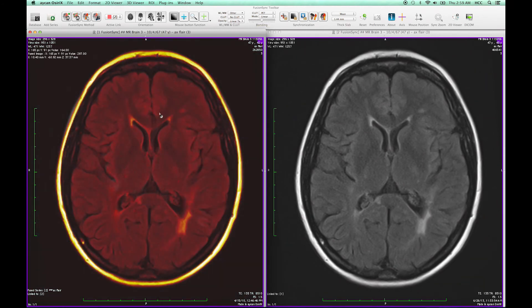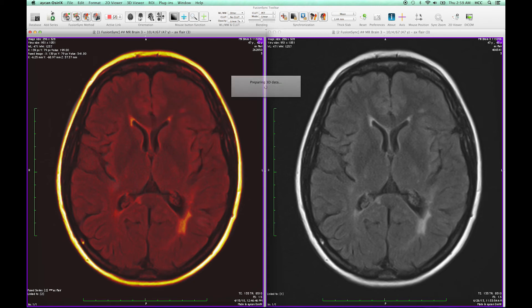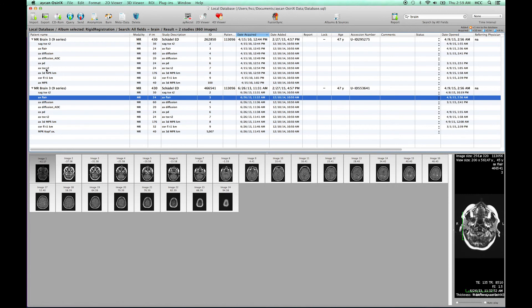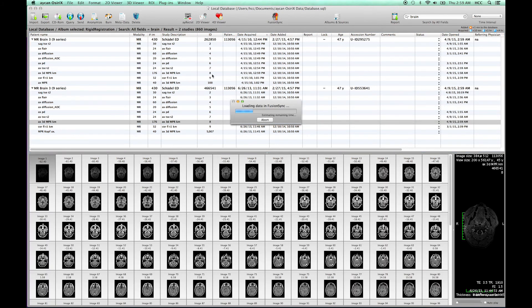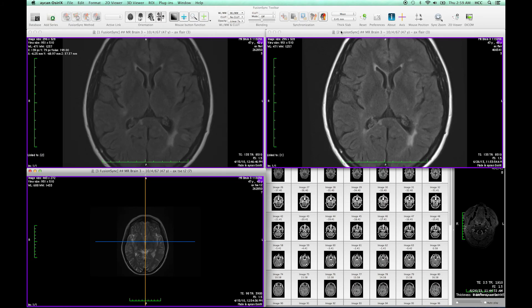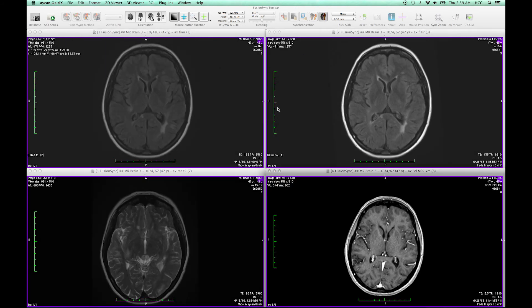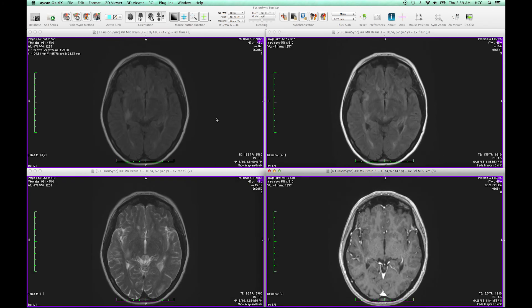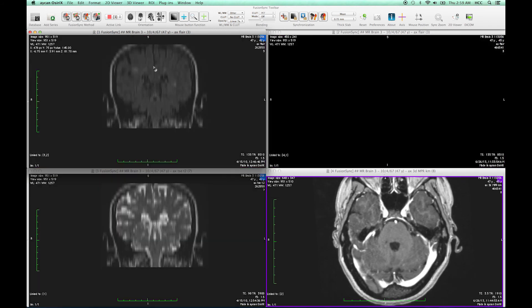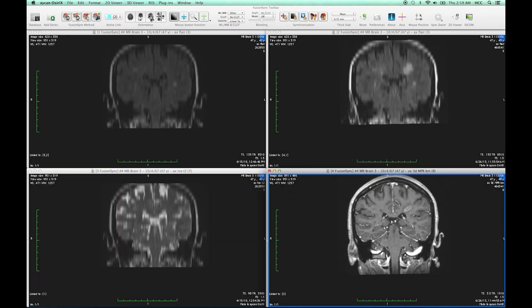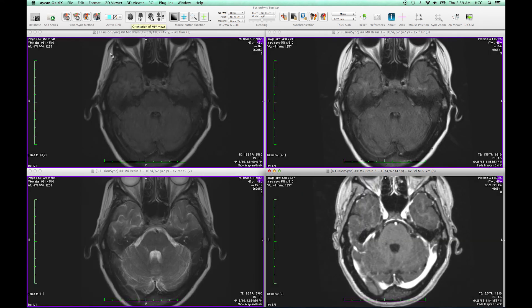But FusionSync provides more than that. For example, we can add additional series for viewing, like the T2 and also a 3D MPR in addition. I can load them into FusionSync as well and let FusionSync apply all the registration between the images. Or we can register different modalities like CT, MR, PET and SPECT, keep the finding bookmarks in synchronization, resample the results to the database, and much more.